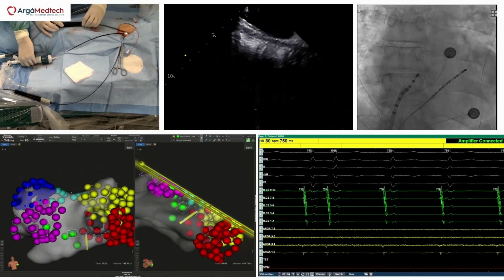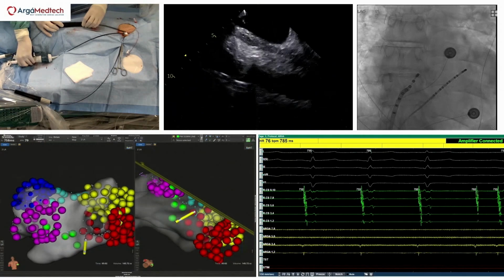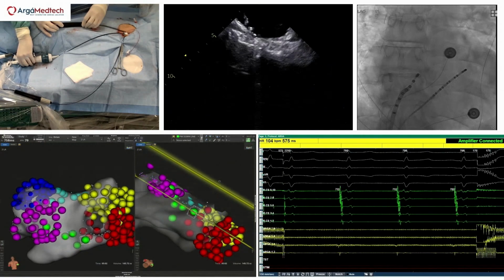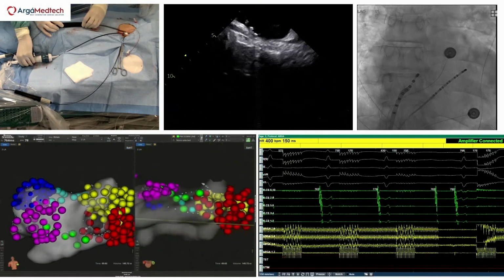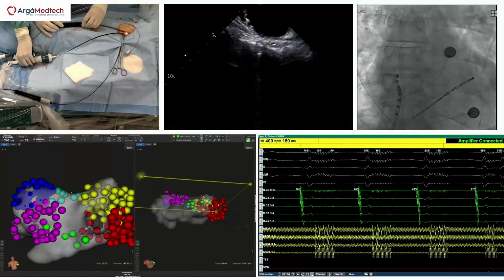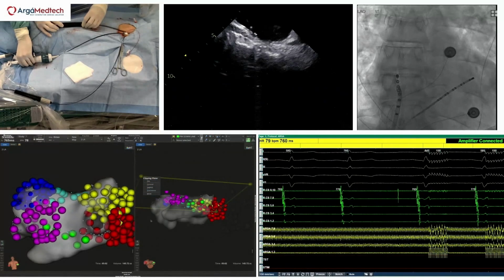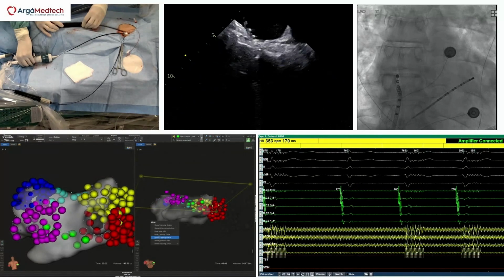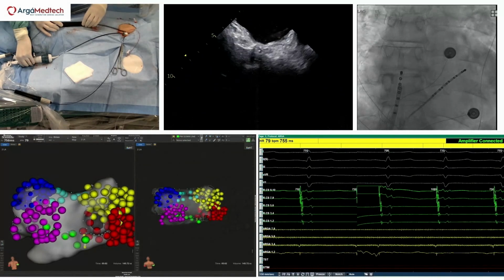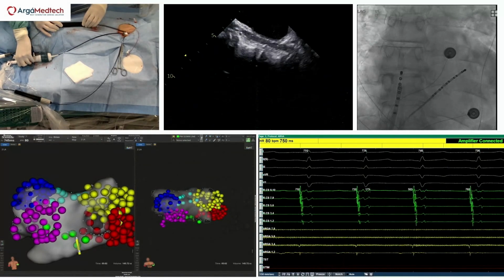Okay, Antonio, point here. Show me contact. Good contact. Go. And then one in the middle, I think will be good. Good contact, stable catheter on ICE. You see on fluoro, we are just finishing the inferior line. I guess the posterior wall is already isolated, but I really want to put another lesion. Let me put one more lesion here to really anchor.